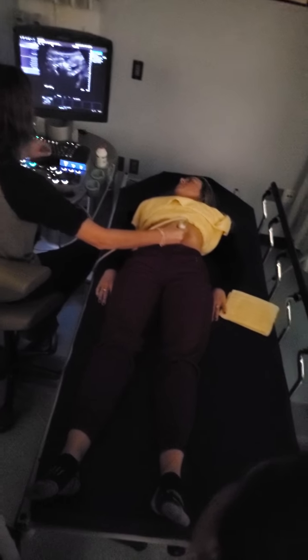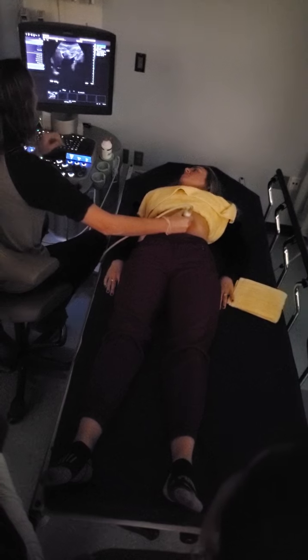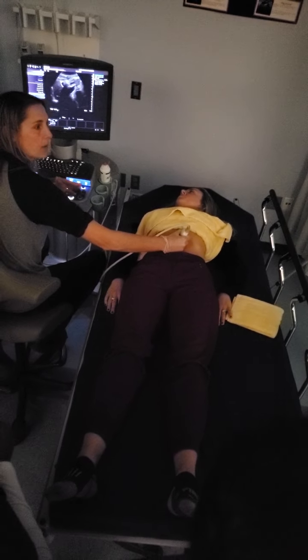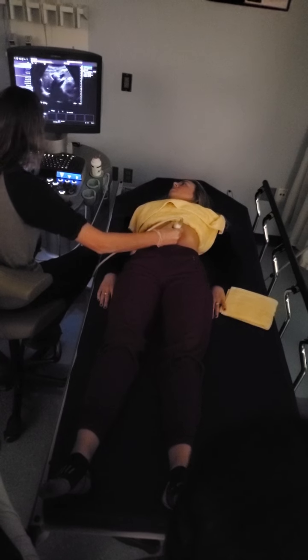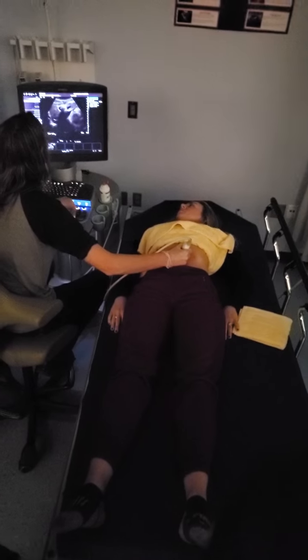doesn't have a breath in, I automatically know I'm going to have to deal with my depth. I'm going to have to add depth. The right liver lobe is a much deeper organ, and when we change depth, what other buttons do we need to worry about? Focus. Foci, you got it. Go wherever that button is. Next to your depth.